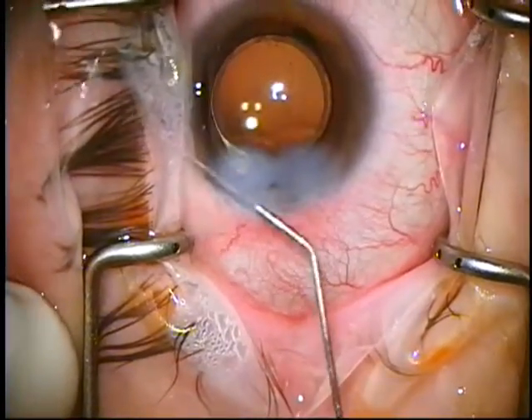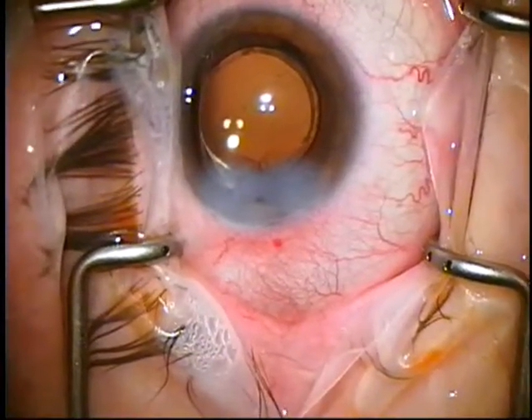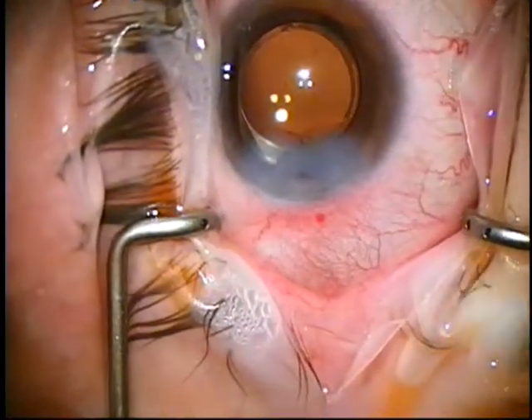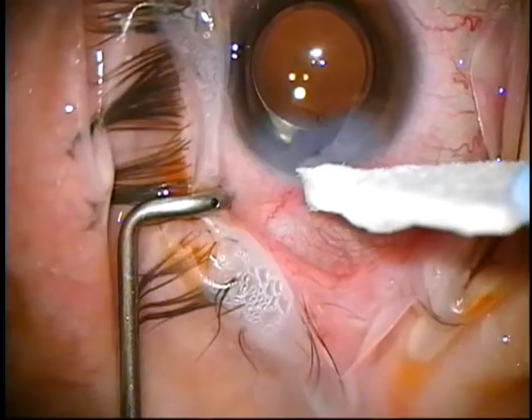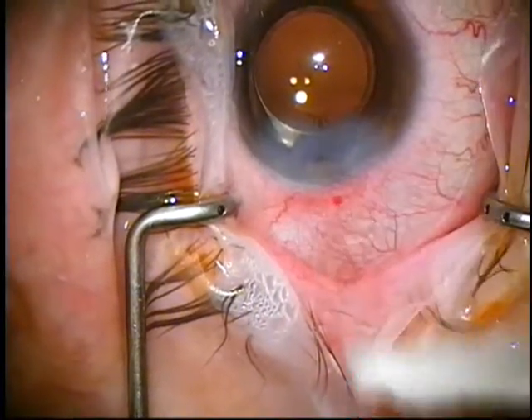All wounds will leak if you push them. So what I do is just gently dry it, and it stays dry. All done.